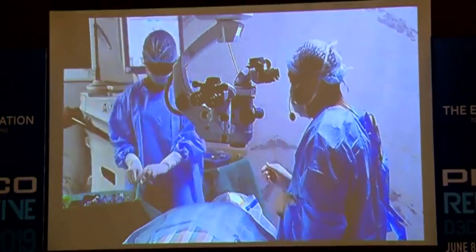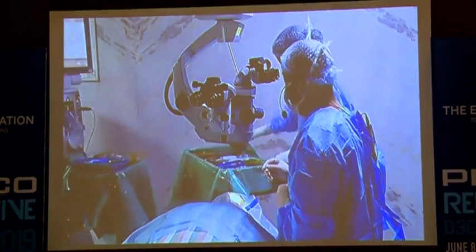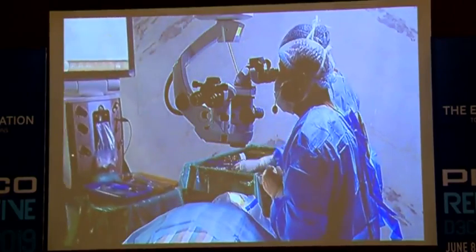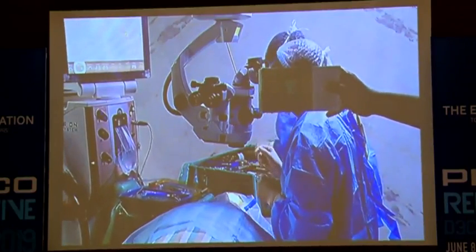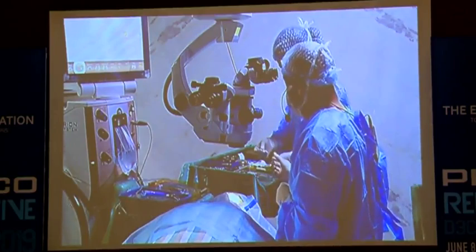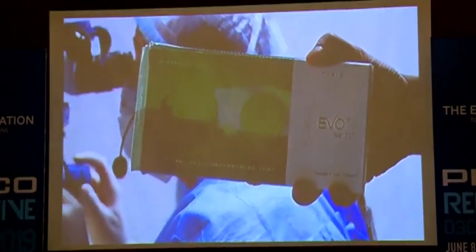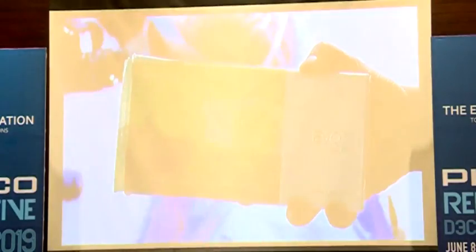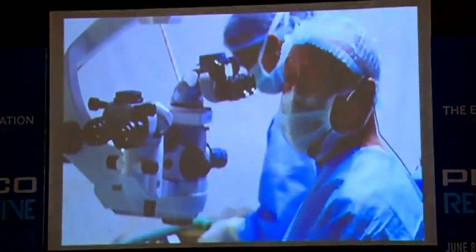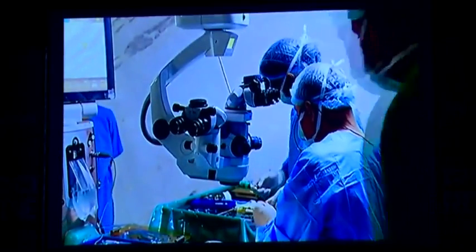Yes, sir. Thank you. We're going to start a posterior phakic IOL. We have taken a Star ICL lens with central aquaport, V4C series. See the young girl, she had a refraction of minus 5 with one cylinder. So the ICL power is minus 7 with plus one cylinder at what axis? Can you portray the parameters? What is this?